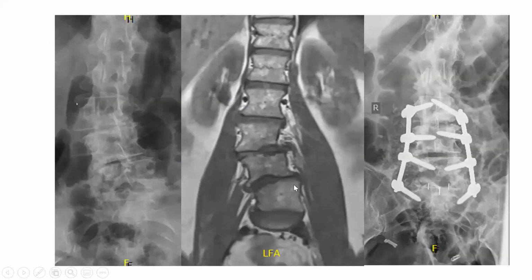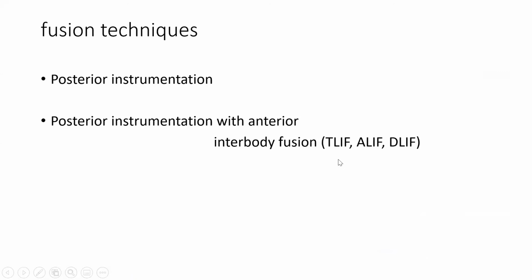There's a patient with deformity. They've got a coronal deformity; he looks like he's falling off to the side. The nerve is coming out here to go over the disc on both sides, and you can only correct this with instrumentation. So it's another reason to instrument. These are posterior pedicle screws, and it looks like there's a cage there.